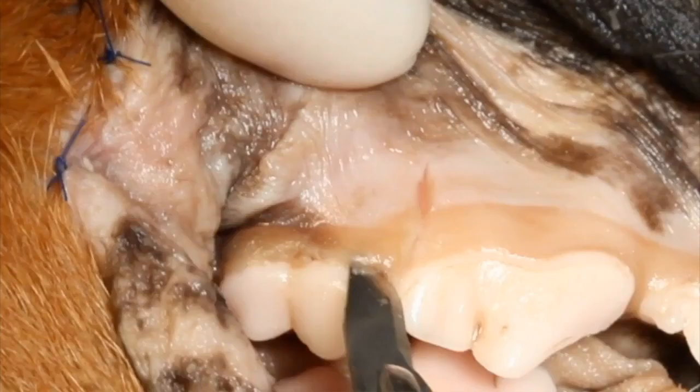With the maxillary first molar, we always do a vertical releasing incision. This is not quite the crowns facing us as much as in the other examples, but you can see it just kind of makes sense — we've got really good exposure, we can see where we made the incision, we can see what we're doing. The crowns are facing us somewhat, but they're pointing down a little bit.